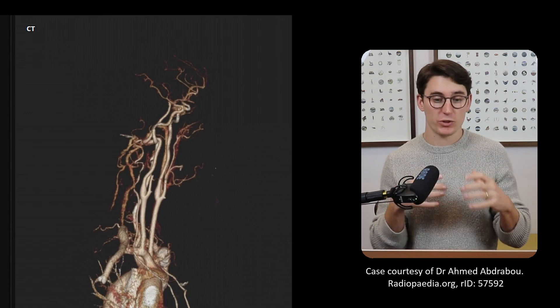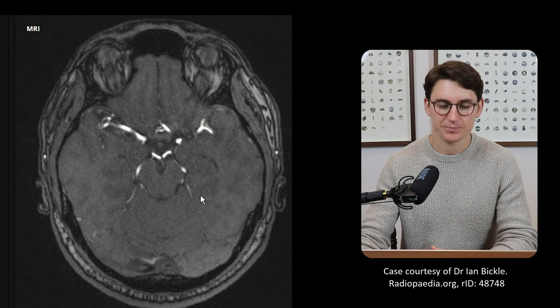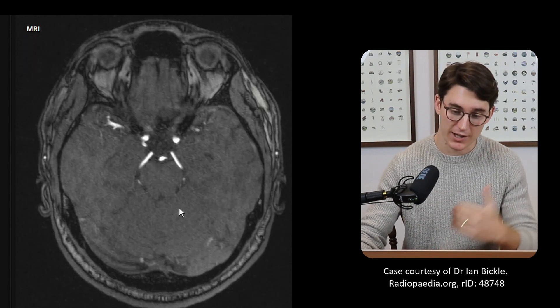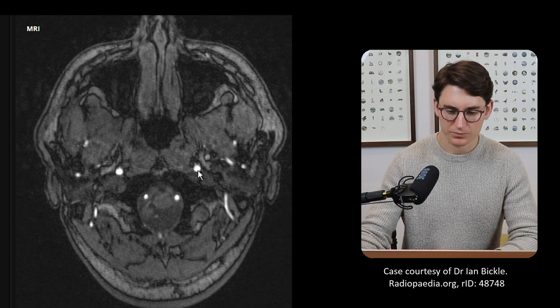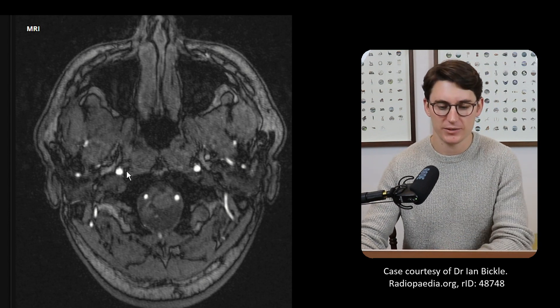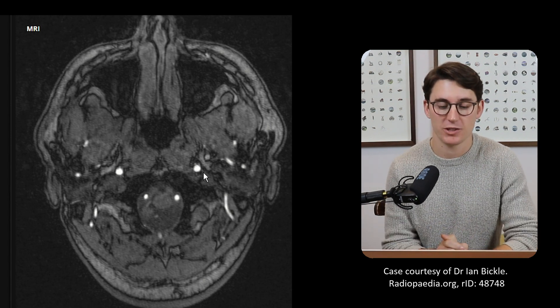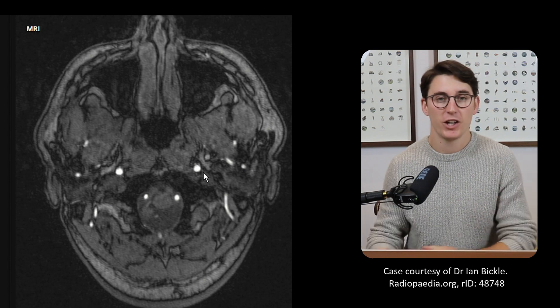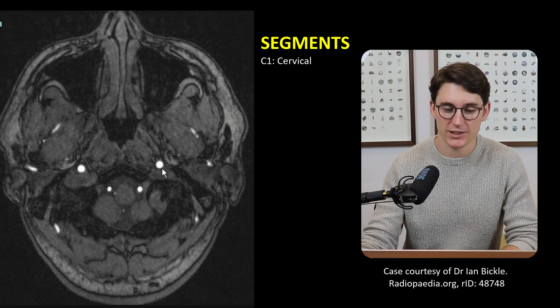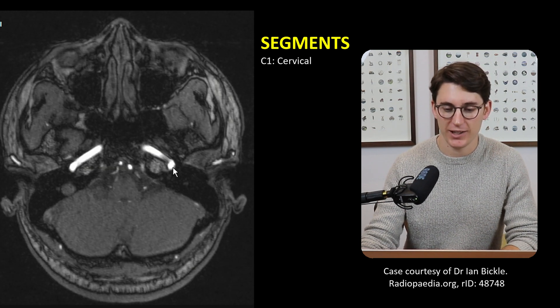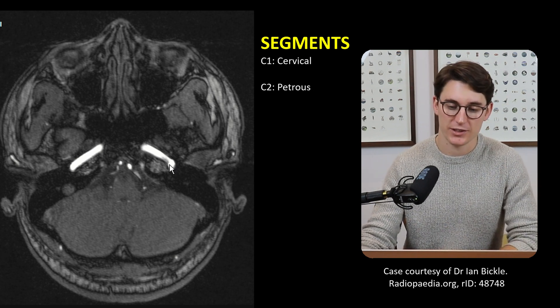So let's look at this in a little more detail. I'm going to switch over now to the MRA, the MR angiogram. Here we're at the level of the circle of Willis; the vasculature is bright, our arteries are bright. Let's scroll down to the neck. We can see our vertebral arteries coming up next to our spinal cord, and our internal carotid arteries — we've already bifurcated. Now let's name the segments of the internal carotid artery. There are seven segments. The segment in the neck after the bifurcation, all the way up to the opening of the carotid canal, is known as the cervical section or C1. Here we can see it coming into the carotid canal — this is the opening of the carotid canal in the petrous section of the temporal bone.